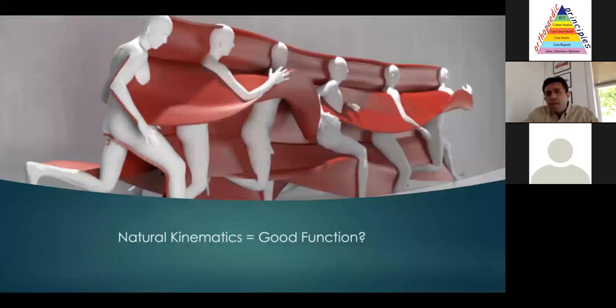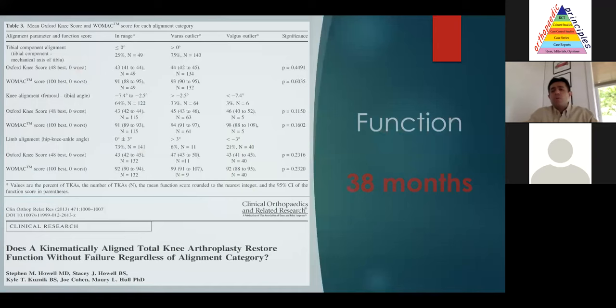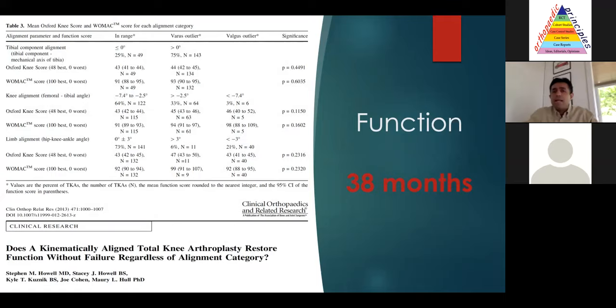But the holy grail is this: do natural kinematics equal good function, or does restoring kinematics equal good function? As surgeons, as patients, that's what we are most interested in. So let's look at that. This is Dr. Howell, who has performed probably the most kinematically aligned knees, and this is kind of his concept here in the United States. He looked at his data and function at 38 months.